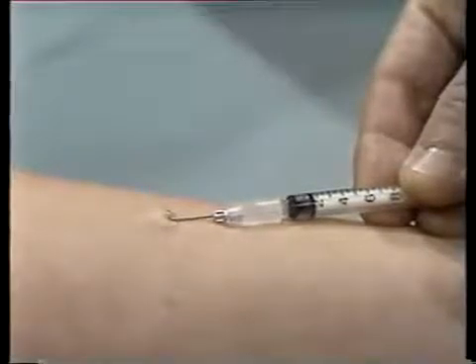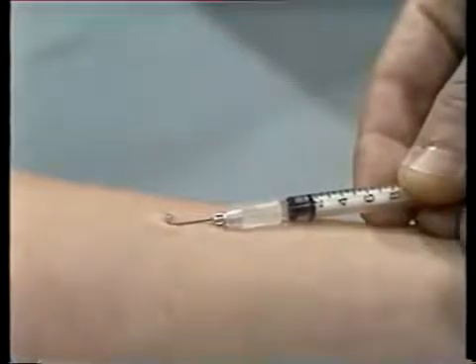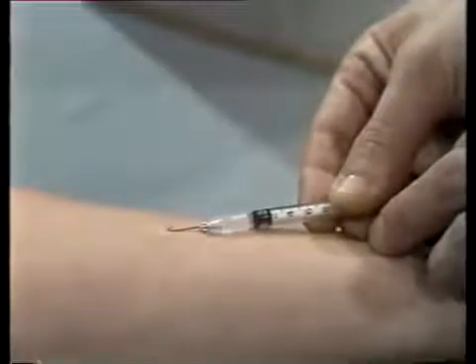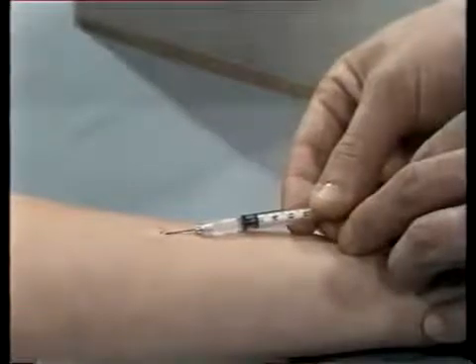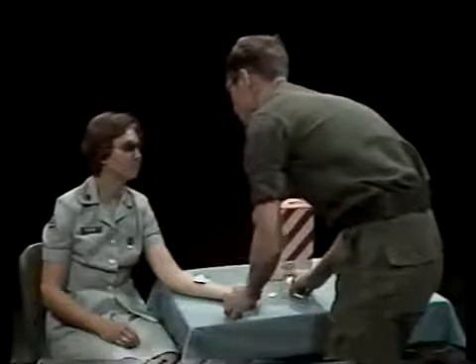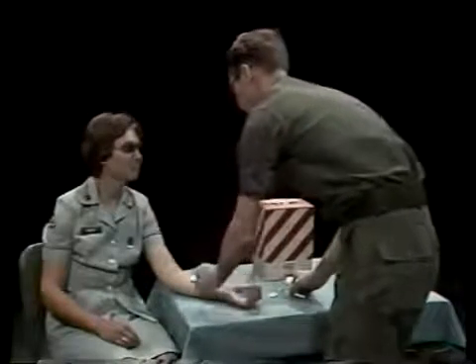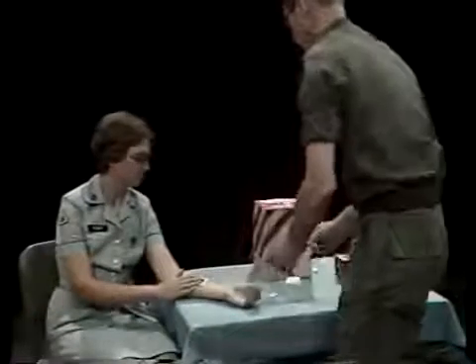Inject the remainder of solution slowly. The small amount of solution you inject will remain in the circular bump under the skin. Withdraw the needle and blot the site with a dry, sterile sponge. Don't massage the circular bump, and caution your patient not to rub or scratch it — you don't want to disperse any of the solution into the underlying tissues. When finished, dispose of your needle and syringe in the appropriate place.